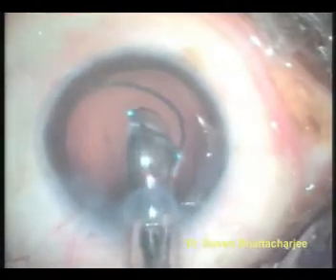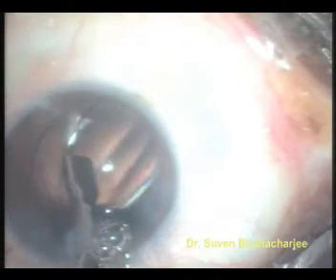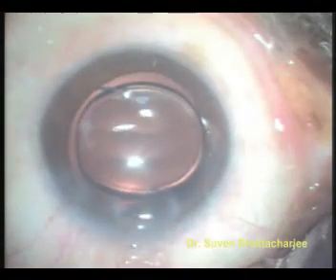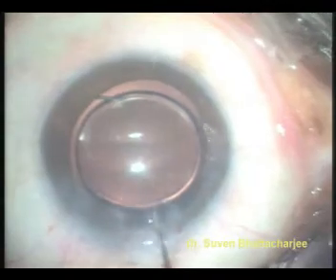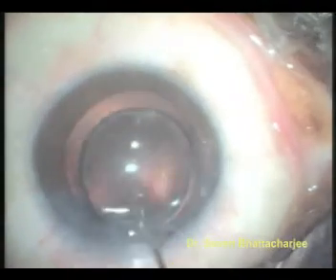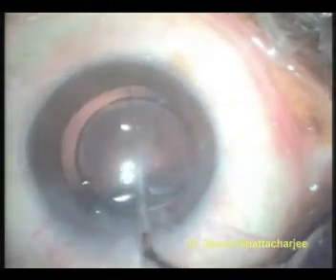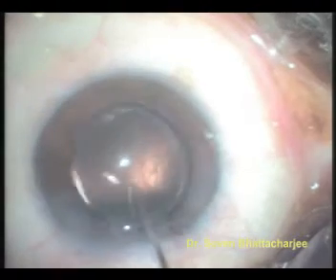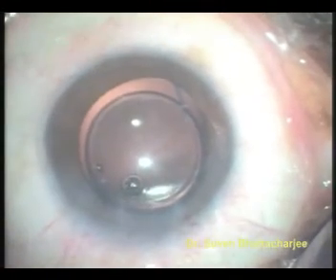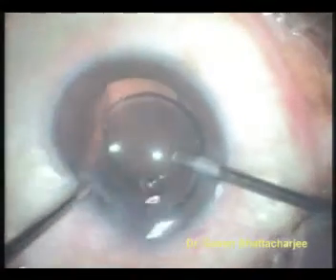As the IOL emerges, it gradually unfolds into the anterior chamber. The advancing rod of the injector is used to tuck in the trailing haptic into the capsular bag. The lens is now rotated in the capsular bag to make sure that it is absolutely well centred. Once good centration is achieved, the residual viscoelastic is removed by bimanual irrigation aspiration.